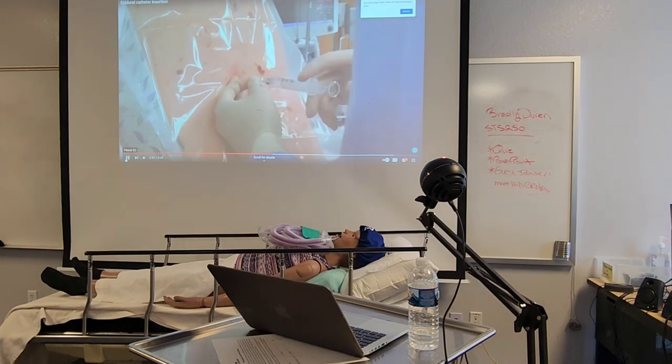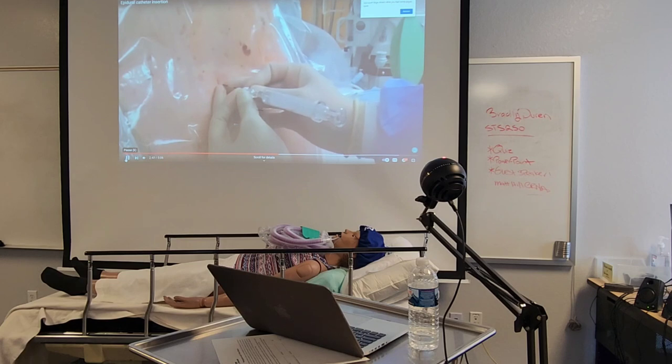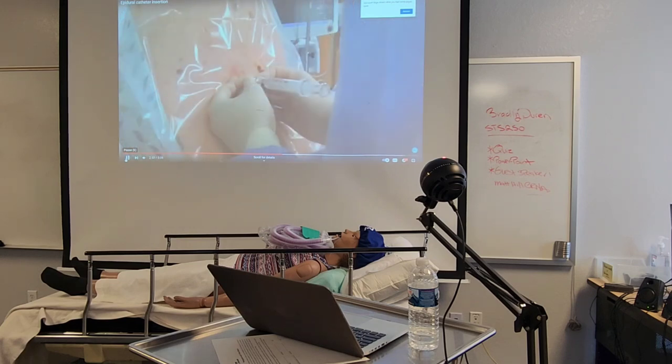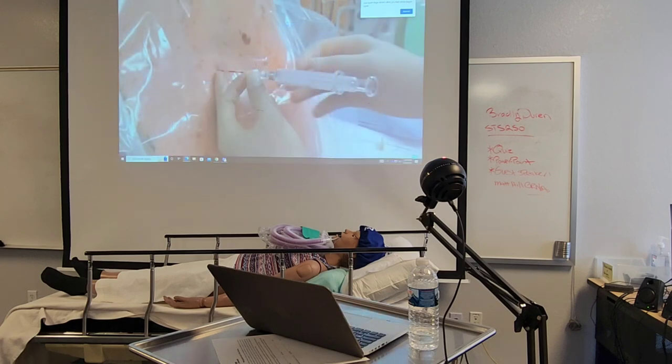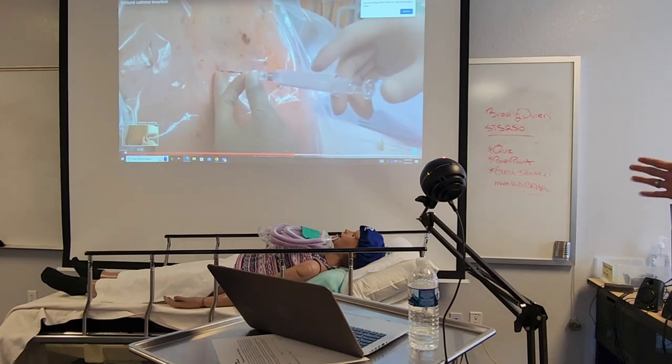Of the syringe, the plunger should not advance. Next, slowly advance the epidural needle in small increments of 2 to 3 millimeters at a time. After each advancement, check for the presence or absence of resistance by gently tapping the plunger with one hand. So you keep pushing on your plunger, the epidural needle stable, and it's not moving, because you're not in the epidural space yet.